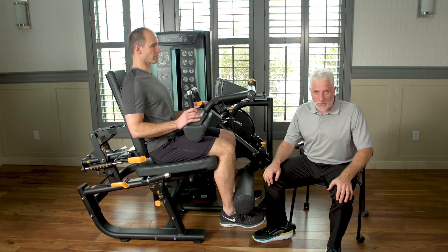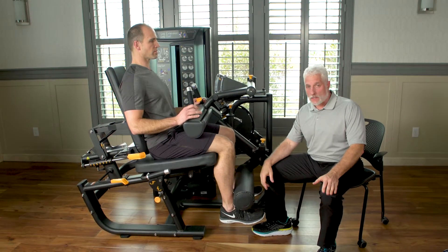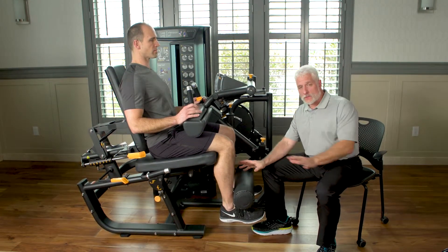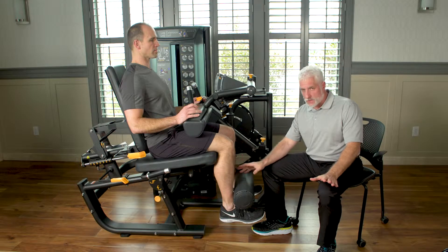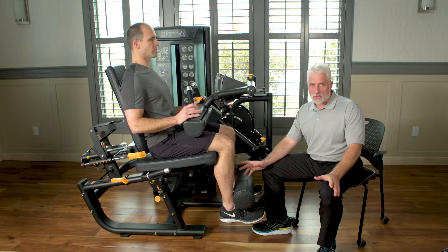If we have a patient that's an ACL reconstruction — whether they're three weeks, four weeks, or six weeks out of surgery — you can work with them on this machine. The difference is, as we all know as physical therapists, you have to range limit their extension so you don't stretch the graft.